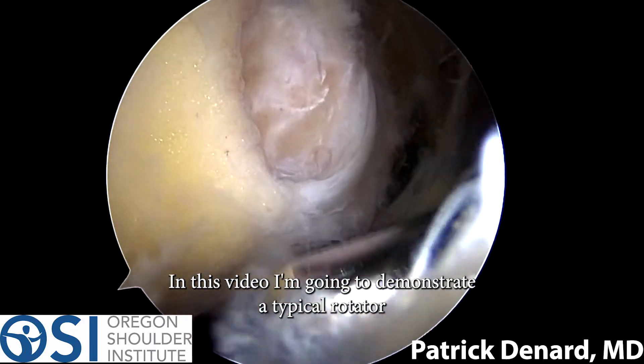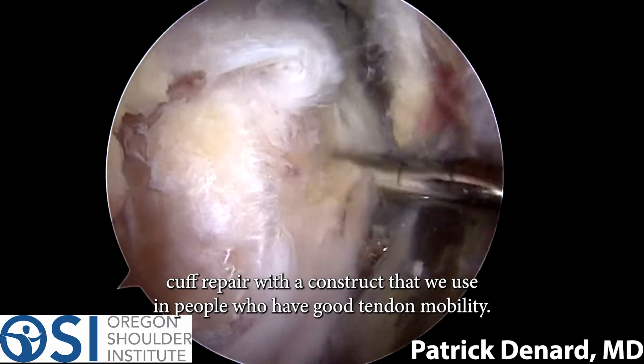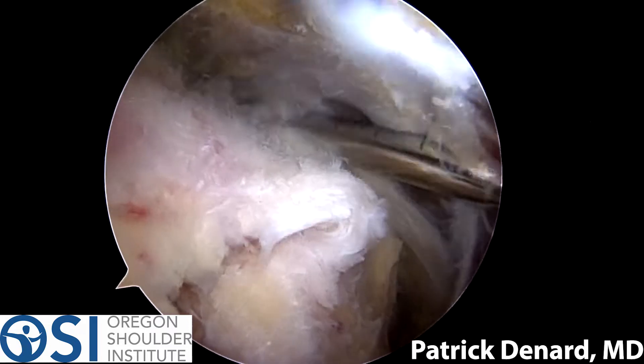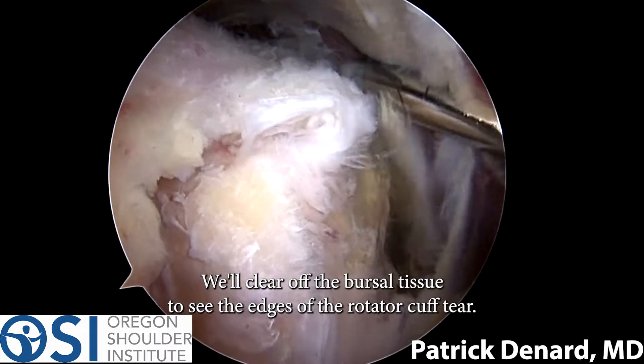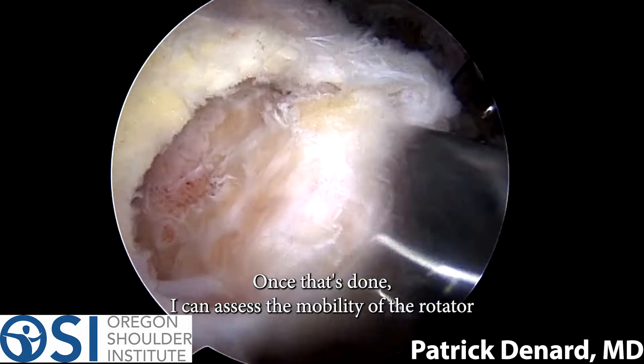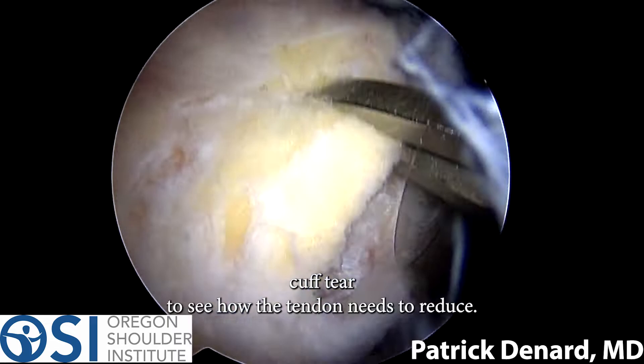In this video I'm going to demonstrate a typical rotator cuff repair with a construct that we use in people who have good tendon mobility. I'm looking from the back of the shoulder, and we'll clear off the bursal tissue to see the edges of the rotator cuff tear. Once that's done, I can assess the mobility of the rotator cuff tear to see how the tendon needs to reduce.